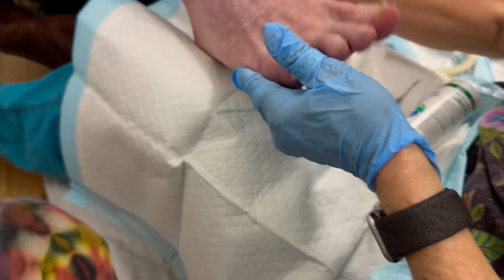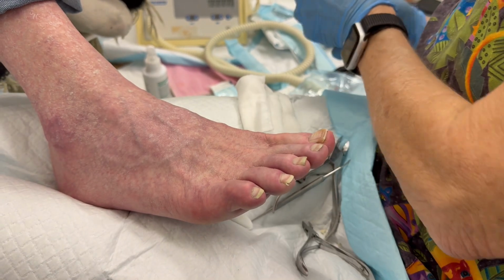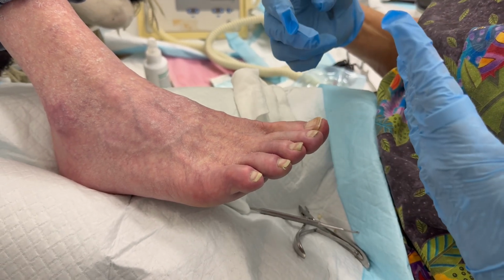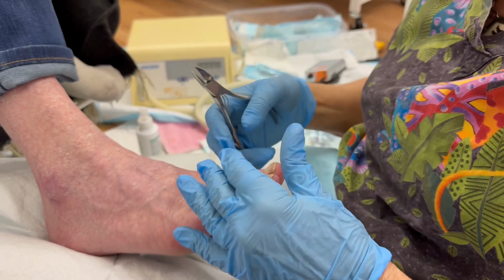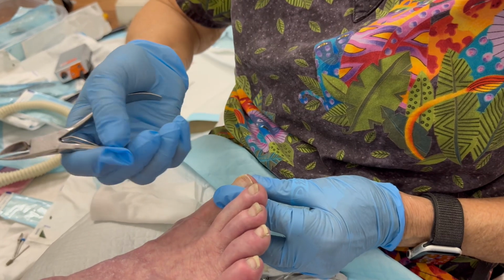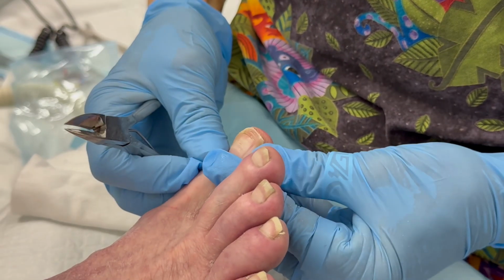I might as well just show you my version of cutting kind of normal nails, because the rest of this stuff, I'm going to put my dirty dishes away over here in this pile of dirty dishes. Okay, now this is the part that could be for lay people, because that's kind of the point of this channel, to teach people not to be afraid of your relatives, friends, or if you're volunteering, how to cut nails. And so you take the nippers, and these are the kind I like. I never use those little toenail nippers that most people have. And you take little bites across. I'm happy there.